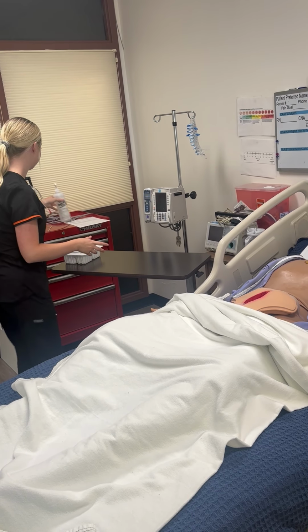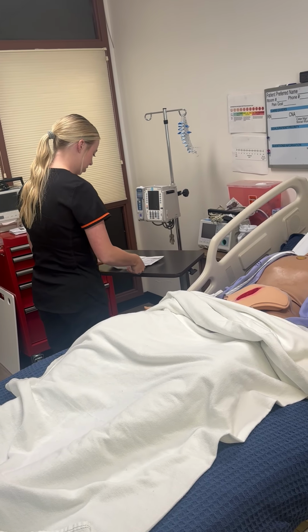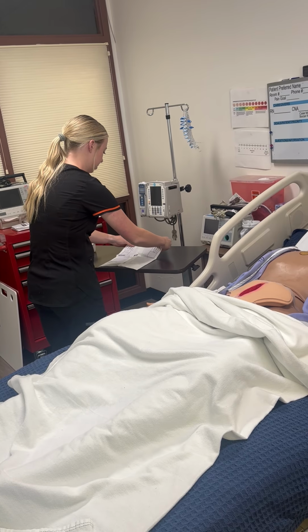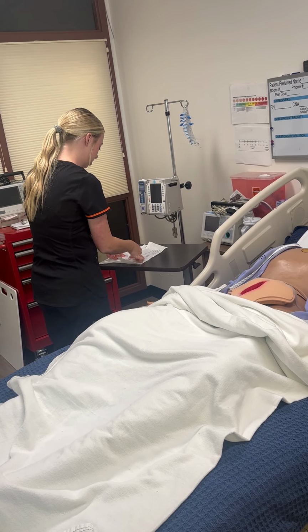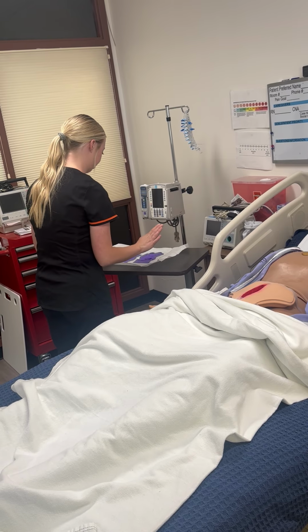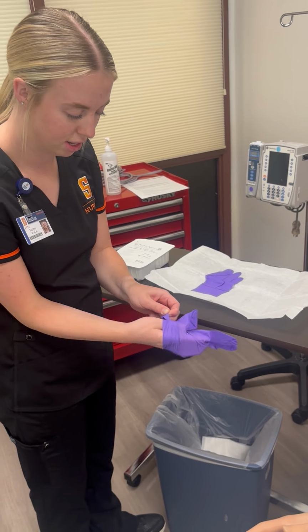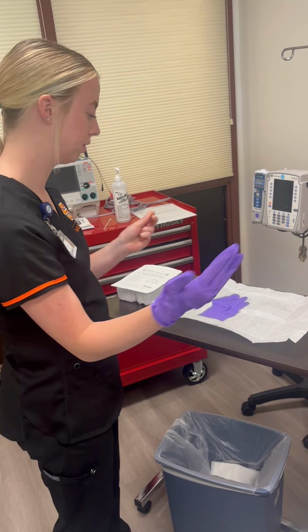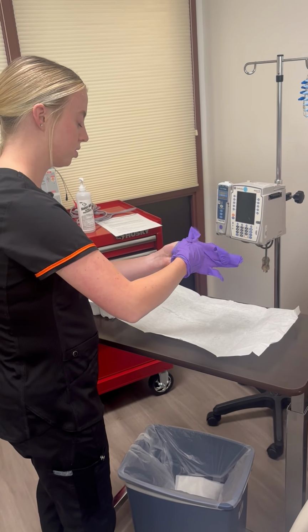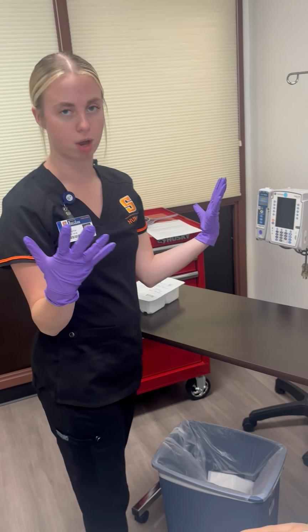I'm now gonna prepare my sterile field, so I'm gonna move this out of the way, and I'm gonna start by getting my gloves on. Fold my flaps down. Oh, that one doesn't want to stay in. I don't want to break field. All right, I'm going to tuck up under and make sure that these stay. Okay, I'm going to put my right hand on first, so I'm going to pinch this part here and slide my hand in, making sure that I'm not breaking sterile field. And now I'm going to tuck up under and slide my next hand in, making sure I'm also not breaking sterile field. And then I'm going to make sure to correct those so they look good, and swipe that out of my way so that I am not touching anything.